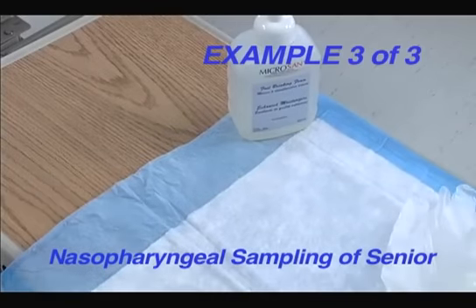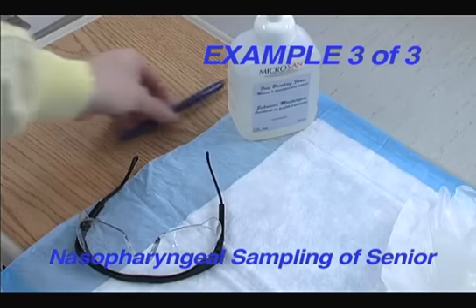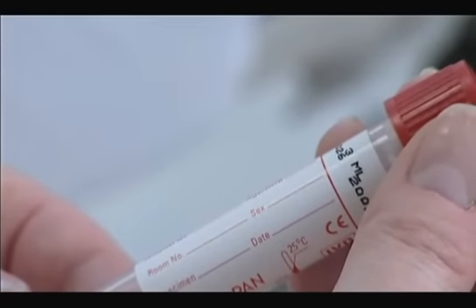Prior to collecting the nasopharyngeal swab, assemble the appropriate supplies such as a pen, requisition, and viral transport medium. Check the expiry date of the transport medium on the container to ensure that it's still in date.